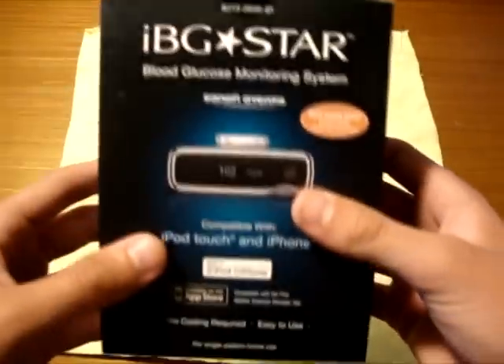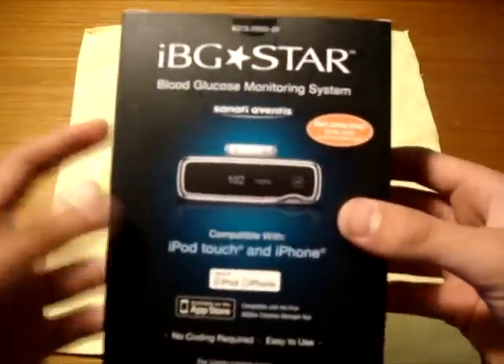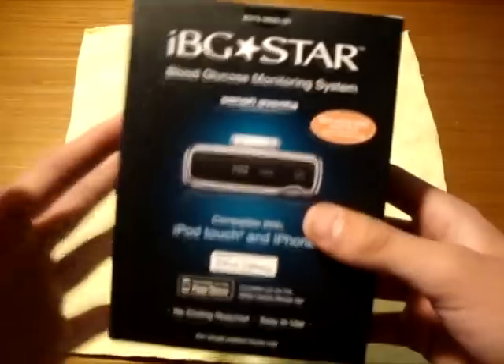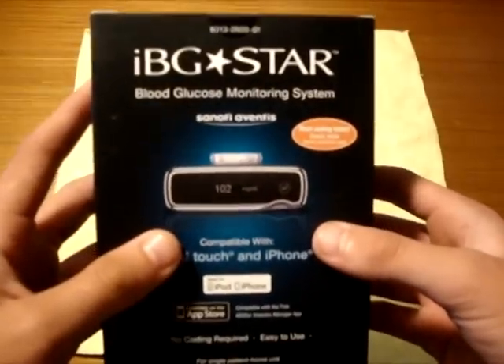This thing is only available in Walgreens stores and Apple stores. I believe it's a marketing strategy from the company to push it out to younger people. I don't know if your insurance will cover it — that's up to you and your insurance. Anyway, let's get into this thing.